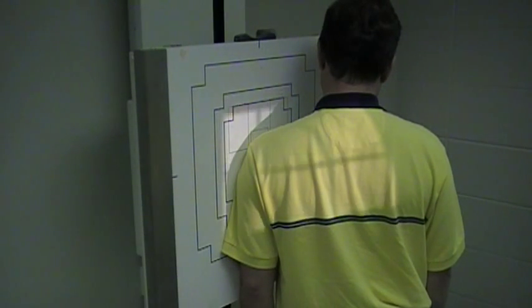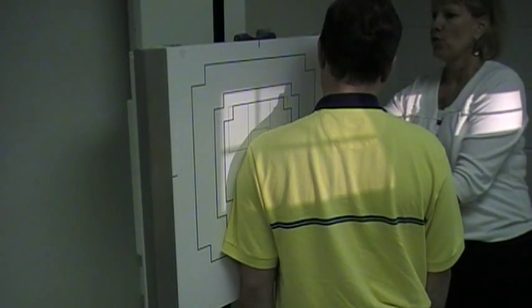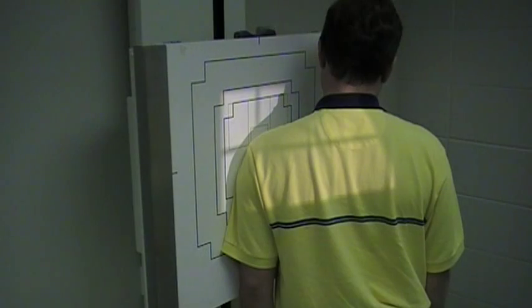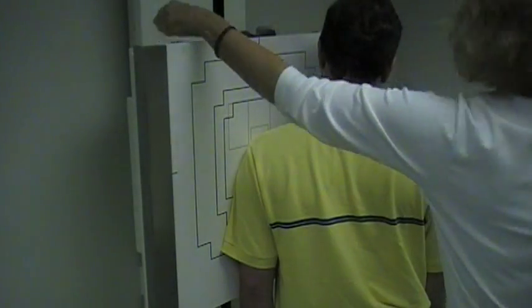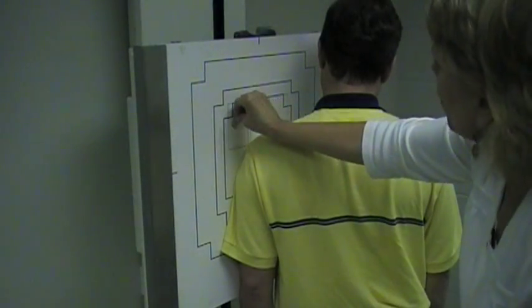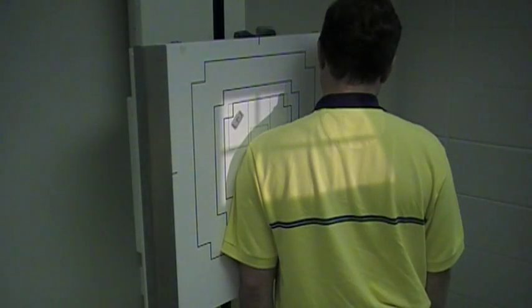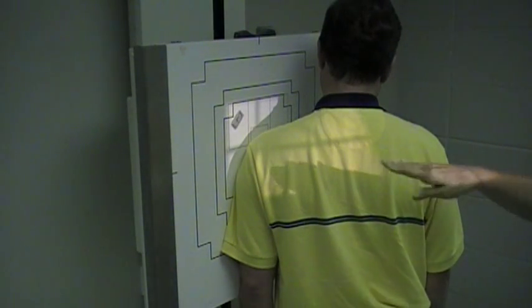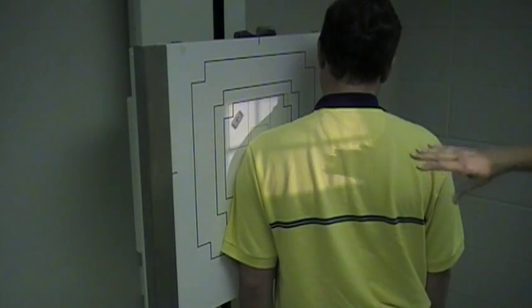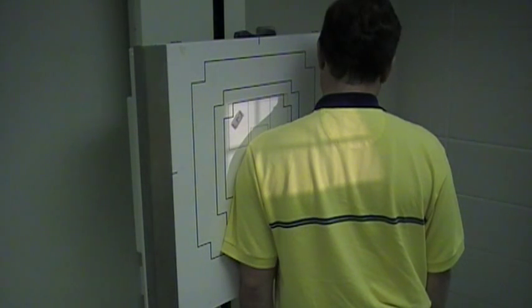I'm going to go actually a little bit higher, and this is showing the supraspinatus outlet. Then we'll place our left marker, since this is our left shoulder that is against the IR, and we can collimate just a little bit. But this is going to skim over the shoulder, just catch that top edge, and it will show the supraspinatus outlet. This is the near method.